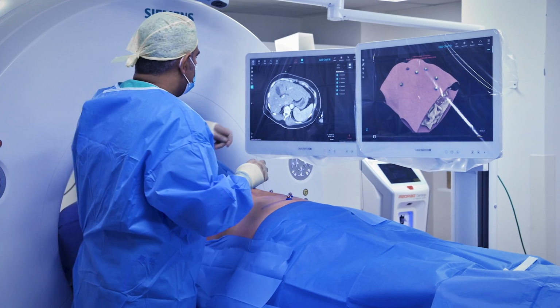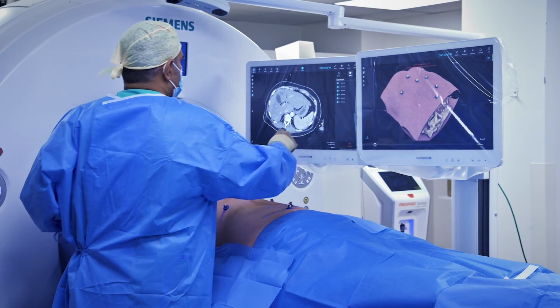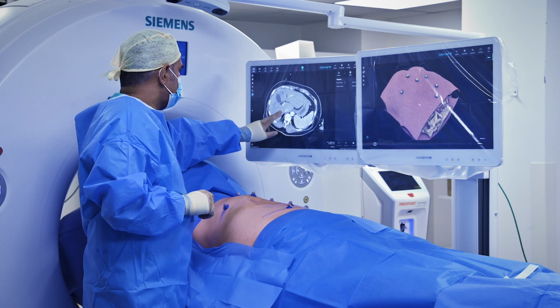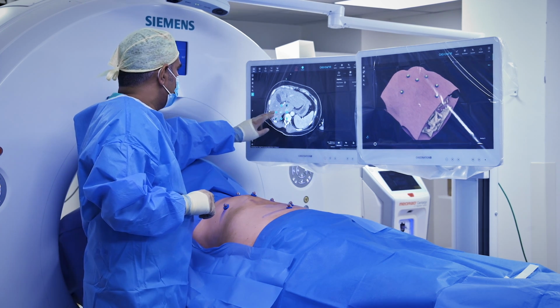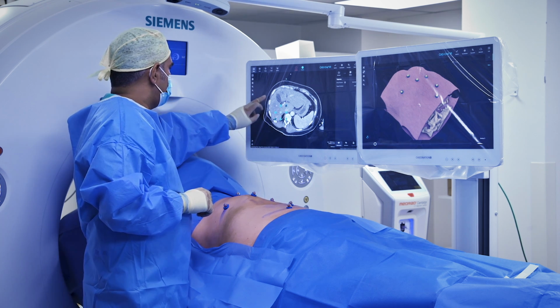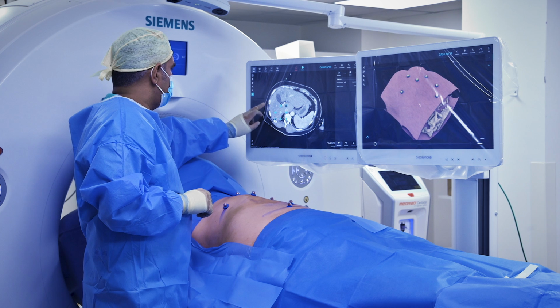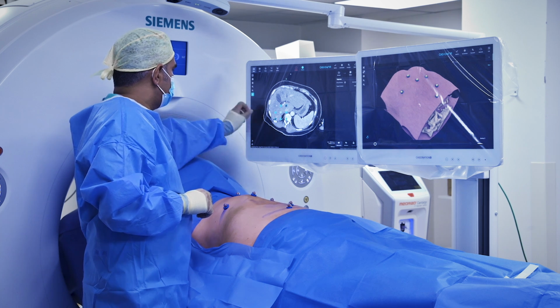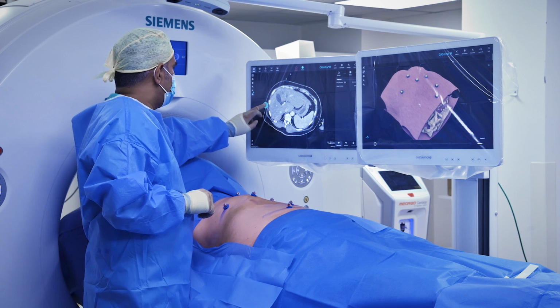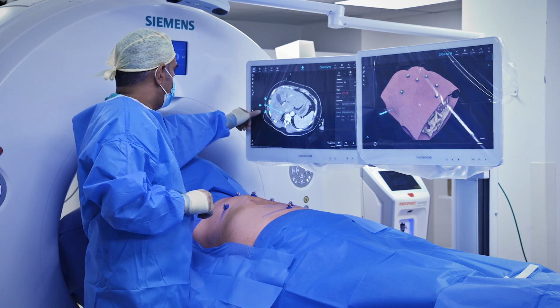So what we'll be looking to do now is to start the planning process, and we'll do this by drawing on the tumour and trying to just define a rough entry point, which may be something along these lines here.